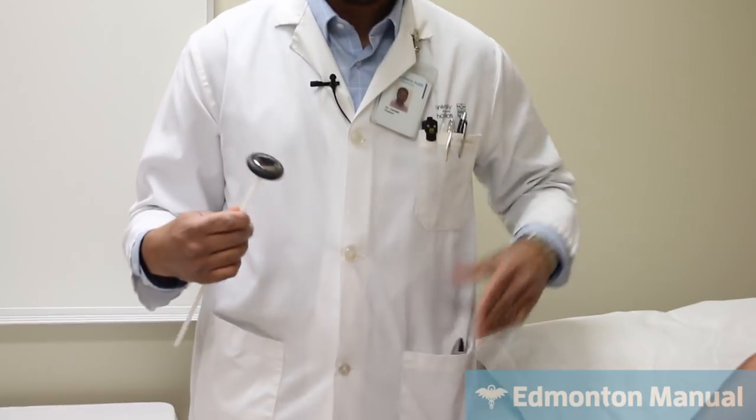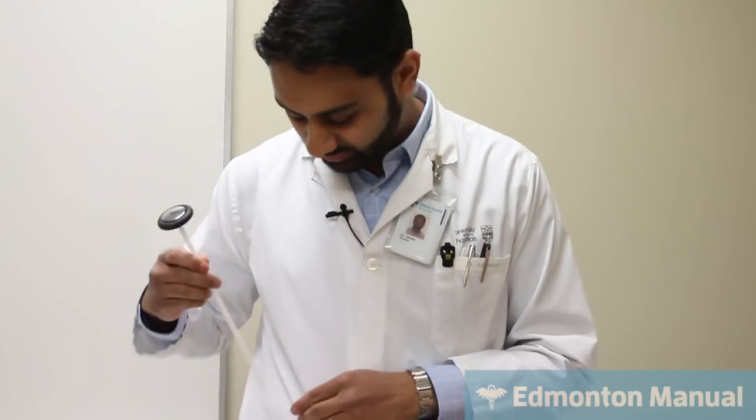So there's nothing wrong with this. In fact, it is the better one in terms of getting reflexes, especially at a novice level. But my statement always is, the best reflex hammer is the one that you can actually carry on you. We look at a typical lab coat, the tomahawk can fit right in there, whereas I find with this one, what do I do with this?